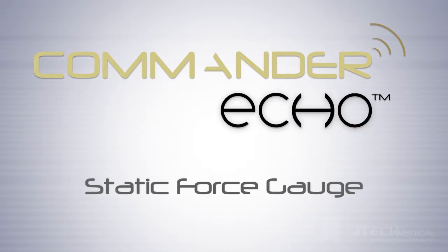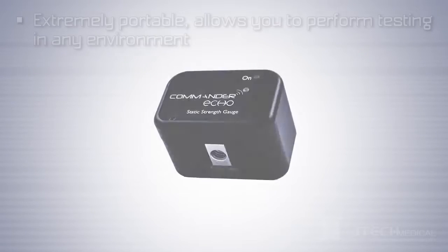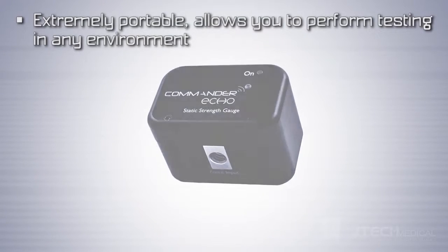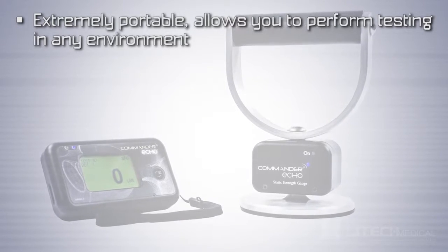Introducing the new Commander Echo Static Force Gauge. Commander Echo's Wireless Static Force Gauge is extremely portable, allowing you to perform functional testing in any environment.